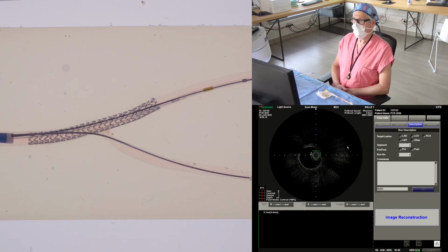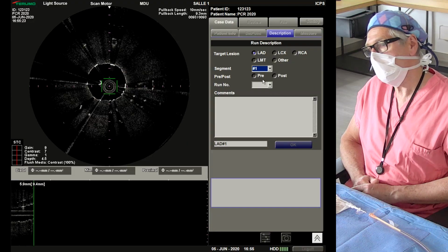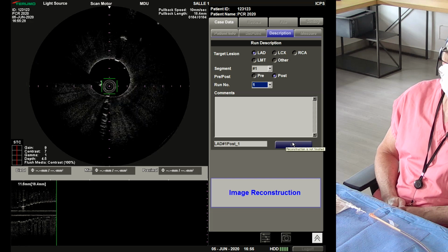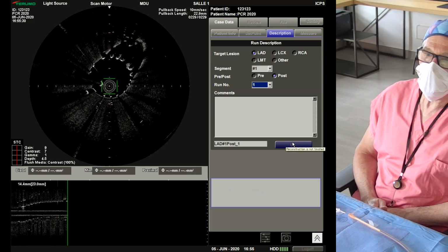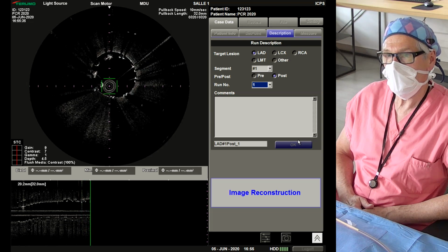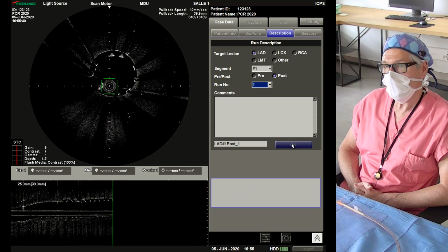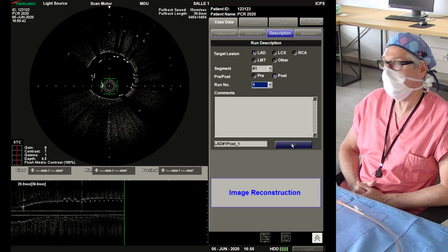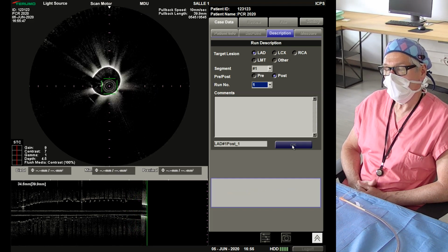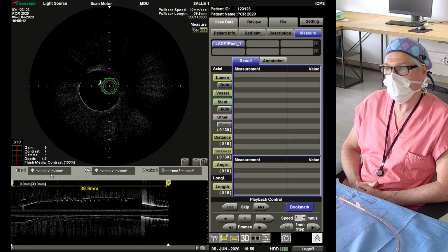Super. Okay, so you have seen the malapposition very clearly. Can we go to a full screen? Okay, so you see the stent well opposed distally, the bifurcation with a lot of strut in front of the side branch, and then malapposition proximally all along the LAD, which was not visible in the screen, in fact. So I think it's a very nice demonstration that if you put a stent, and don't do a POT, you do something which is not optimal.